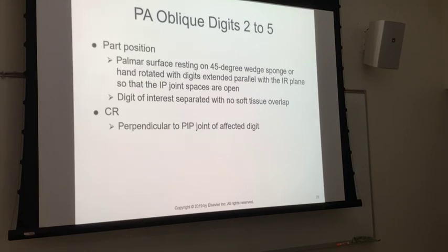All right. So what you'll see in a lot of cases is your technologist will shoot PA, and the oblique is going to go in the same kind of general direction as the laterals. So you'll shoot PA, and you shoot a 45 degree oblique, and then you'll roll up into a lateral. In a lot of cases, it's just the routine if you happen to shoot 3 views of the finger. And in the finger itself, the oblique really doesn't show you a whole lot more than what the PA and the lateral will. But some hospitals call for 3 view. So it's 45 degree oblique.